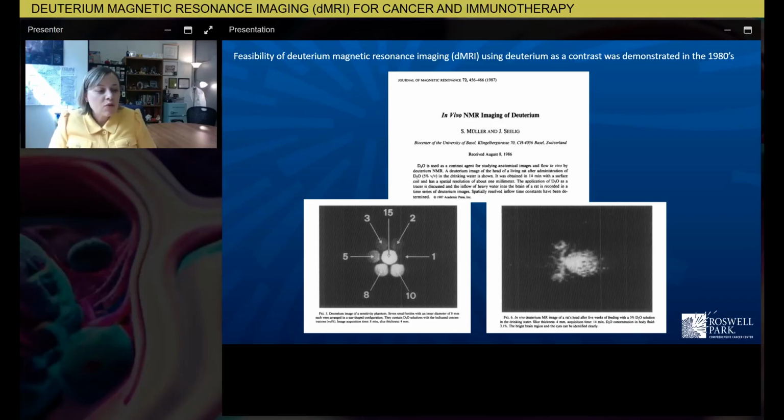Why that makes a difference is because, as I hope I have already explained, deuterium incorporation is a proxy for cell proliferation. So we had this idea of maybe we can use this to image tissues with high proliferation rates non-invasively with whole body imaging by MRI.